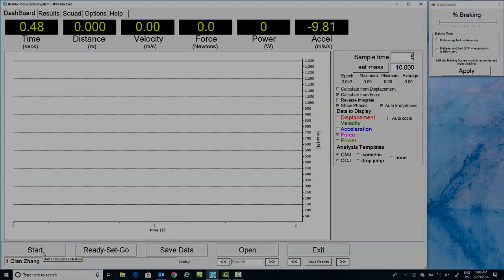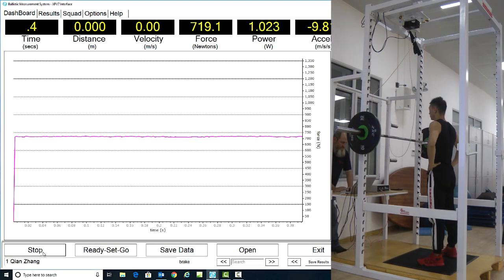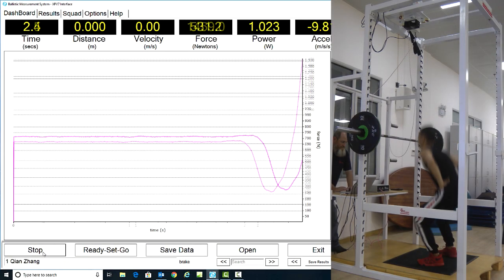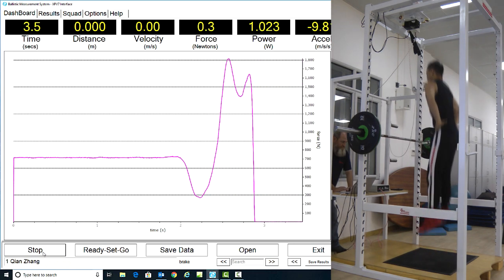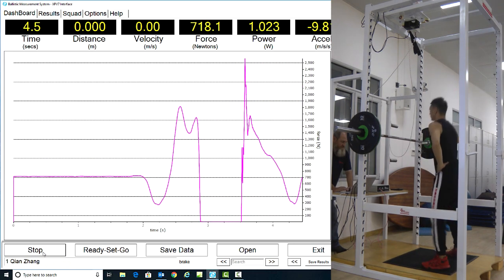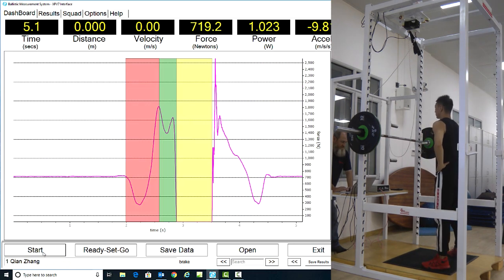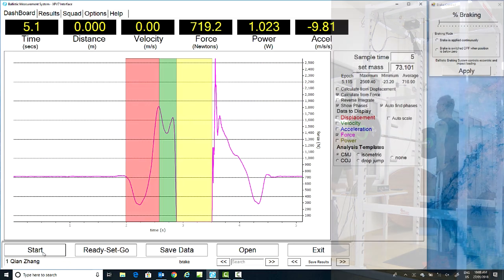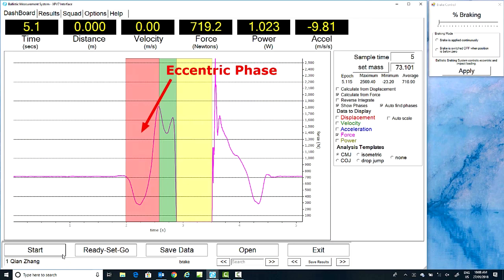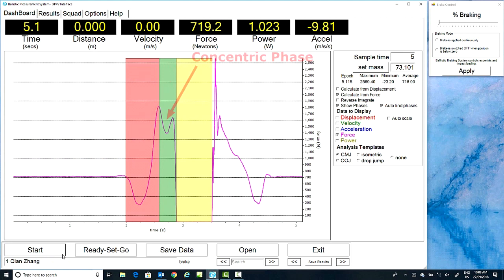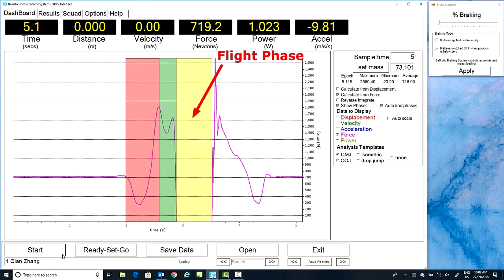The counter-movement jump template can be seen in action here. As the athlete completes the jump, the eccentric phase, the concentric phase, and the flight phase are all automatically determined.